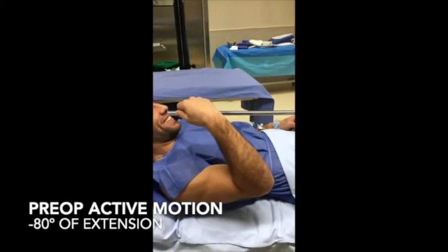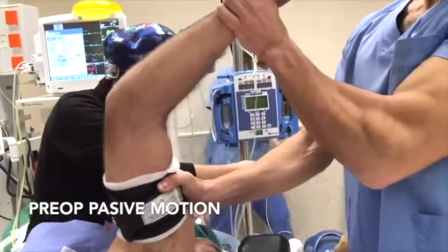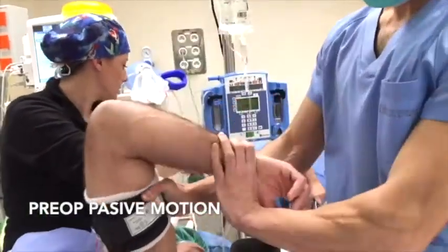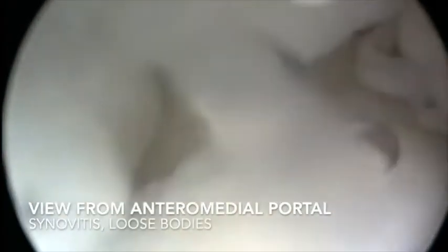This is a period of examination of the passive anatomic motion. We performed an arthroscopic arthrolysis of his elbow to improve his function. First, we put the scope in the anteromedial portal and from the anterolateral portal we tried to extract all the loose bodies in the anterior part of the elbow.